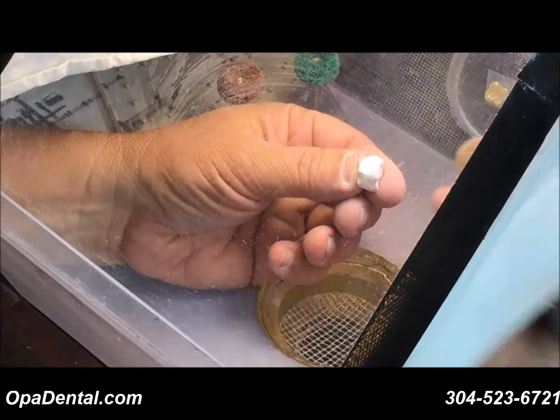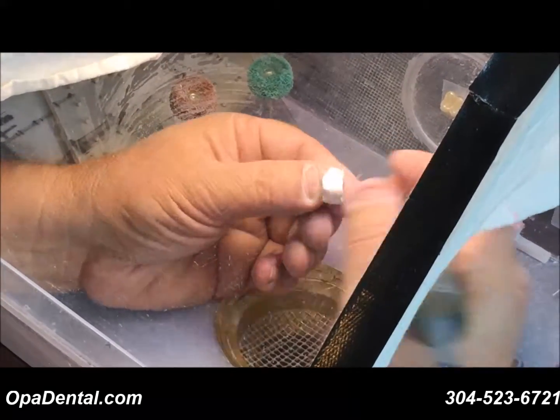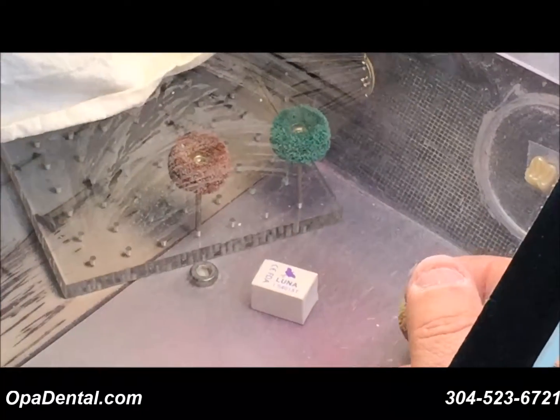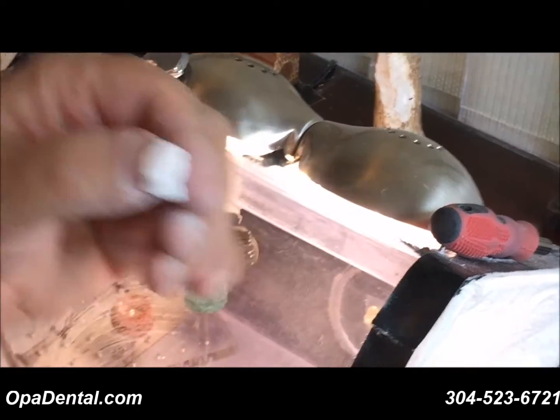I'm going to work on just two surfaces — the distal and the buccal of this molar. I've even added some extra grooves in here to make it just a little rougher. Hopefully your mill doesn't mill this rough, but I just wanted you to see how nice these shaping brushes work.